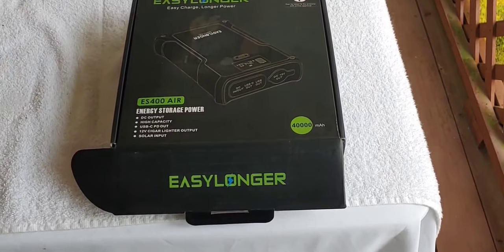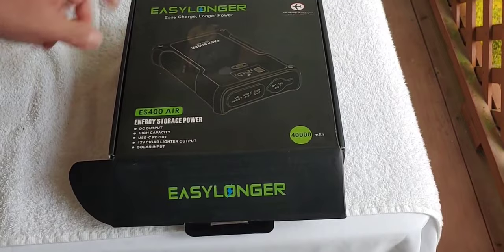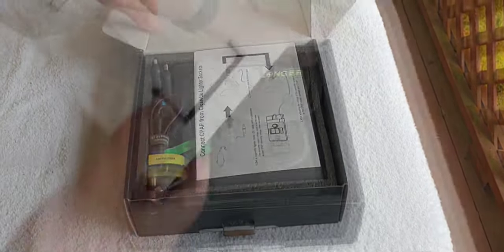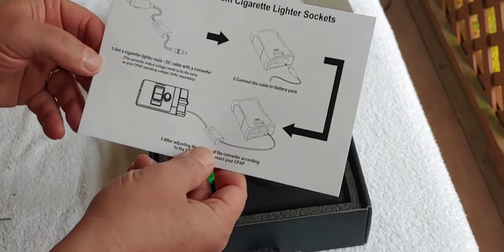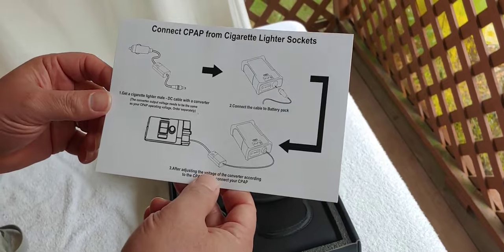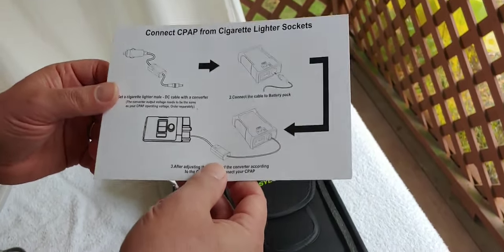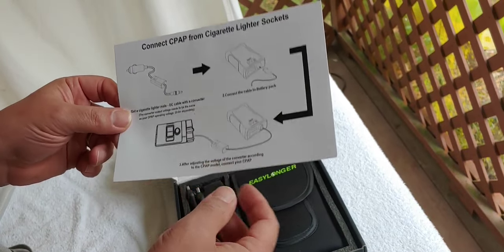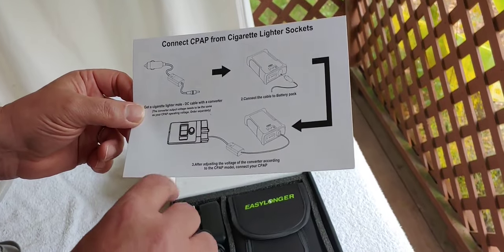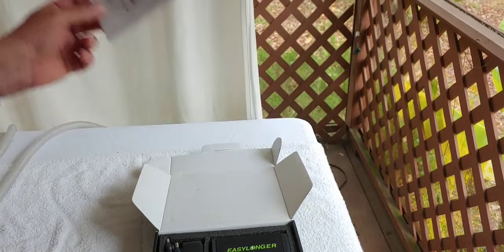So let's go on with this one. It's an ES400 — it's an EasyLonger — and we're going to open up the box and see what we have here. This is mostly for CPAP machines, though you can use it for other types — you can charge tablets, laptops, phones. But I'm showing it because so many people use CPAP machines and with power going out so frequently, I wanted to show you easy ways to overcome that.